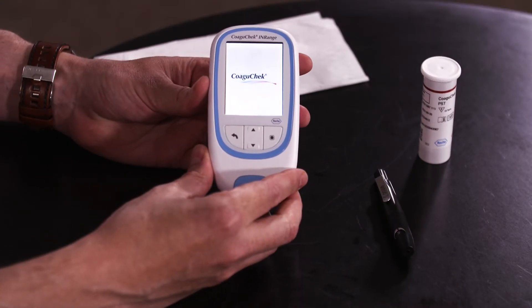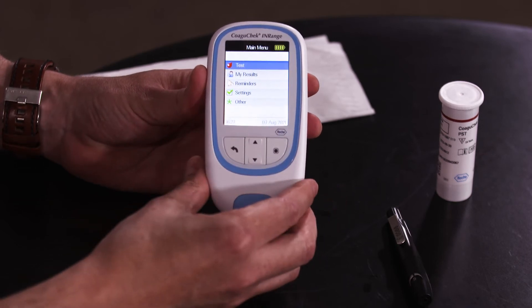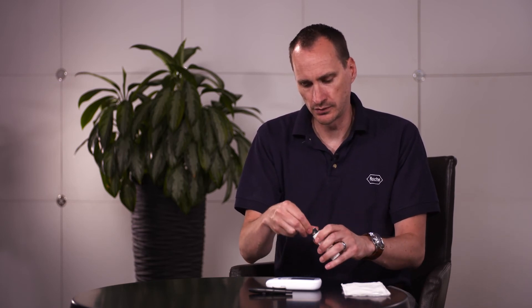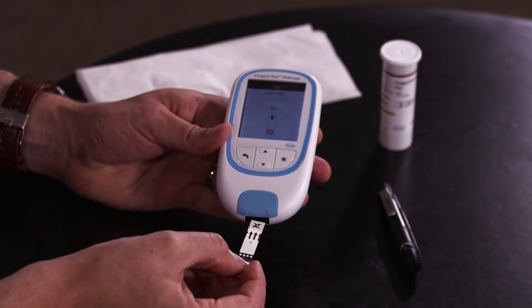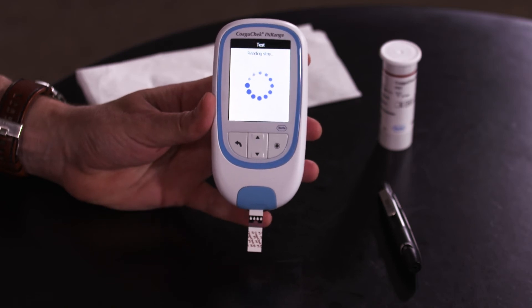To perform a test switch the meter on, ensuring you have enough power by checking the battery symbol. Also check the time and date are correct, then select test. Only insert the strip when you see the symbol of a strip and a meter on the screen. Take a strip out of the pot, ensuring you put the lid straight back on, and insert the strip into the meter. The meter will then warm the strip up and count down 180 seconds. Only lance the finger when you see the countdown begin.